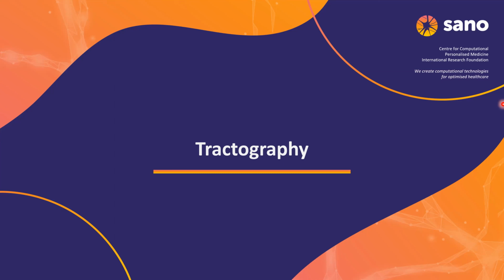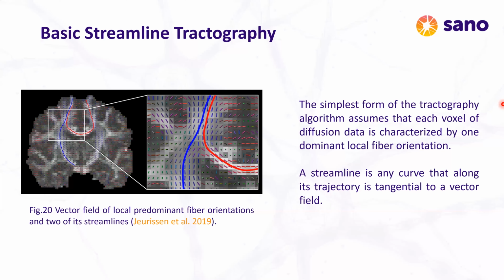At the beginning, we'll briefly explain the concept related to tractography based on diffusion-weighted data. The term fiber tractography refers to any computational procedure by which the anatomical trajectories of white matter pathways can be estimated from diffusion-weighted magnetic resonance imaging data.